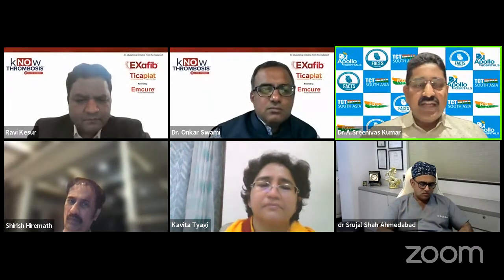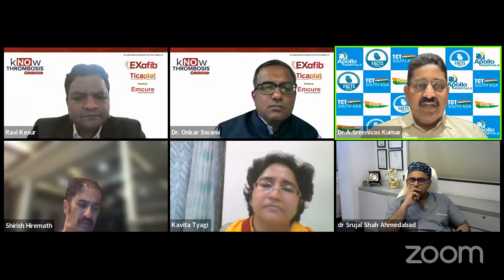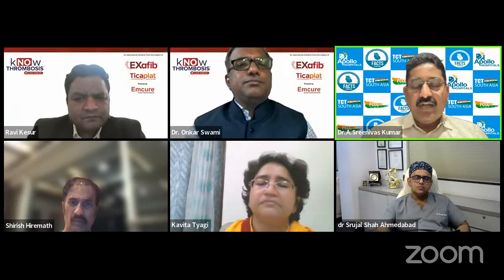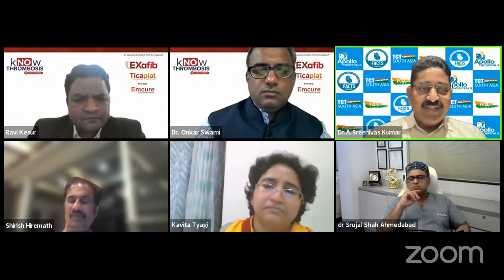But you did show some LCX procedure done before LAD, is it? Yes, sir. So normally, just for learning sake, maybe it's a simple lesion, you thought you could tackle it easily before and do it. But generally, as a dictum, we tackle the toughest lesion first. And then suppose anything happens and you're not able to tackle well, the patient can get the benefit of surgery. Now, Hiramat sir and most of us, there is no surgery. So that's why you must have thought anyway you won't send for surgery. You must have tackled LCX.